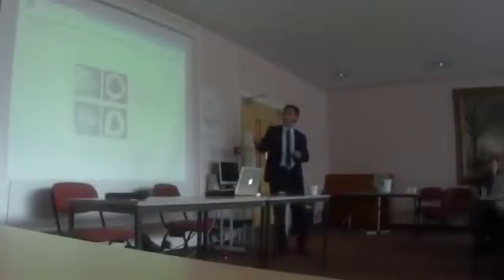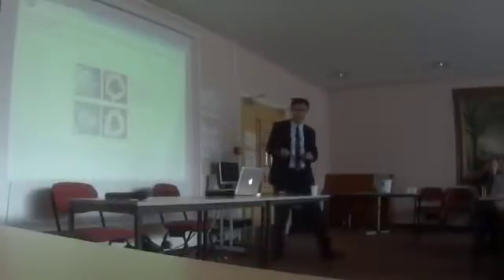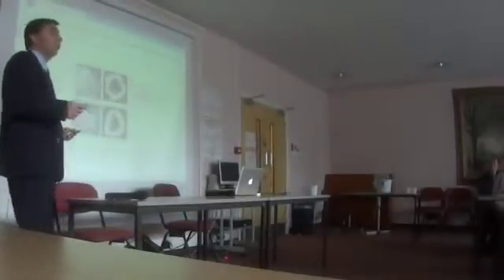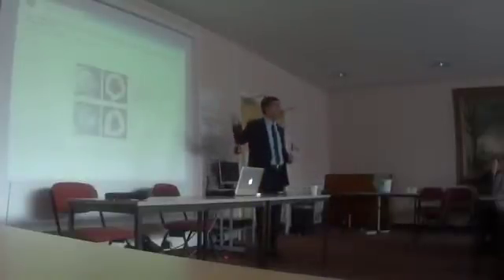This is again patients who had dilated cardiomyopathy. We showed if they have a scar, I don't know if you could see it from there, which is this white bit within the boundary of the heart, the dark is the heart, and this is a scar, and this is the autopsy, which is exactly the same thing. So you don't have to autopsy someone alive. You can see this, and then this patient has a higher risk than somebody who does not have this scar.